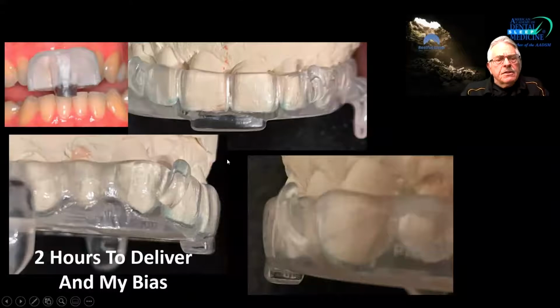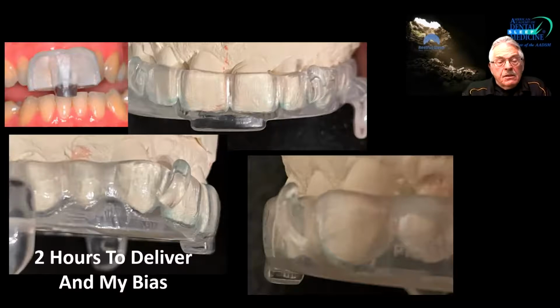So this is something that I hope is of value to you too. An NTI, when we call it an anterior midpoint discluder, it's narrow and a little longer. Sleep appliance manufacturers seem to want to make these broad, okay? They're more of a platform than a midpoint stop. I continually have to get them to make these narrower. I'm not sure that's significant or not in a sleep appliance, to tell you the truth. But we call it an anterior midpoint stop, not an anterior midpoint platform.